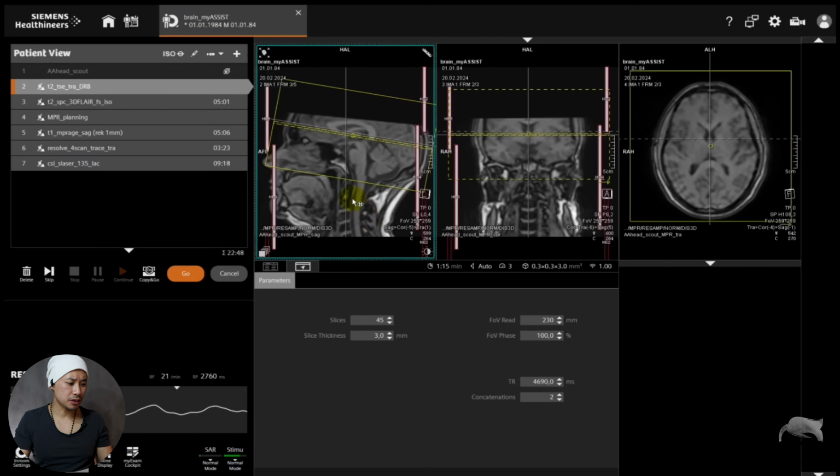So let's position this T2. Okay, you can see the localizer here is not good because I had to do it in a hurry. Nonetheless, it will cover the whole brain and the T2 and all that, but don't mind the localizer. Okay, we finished with the T2 positioning.